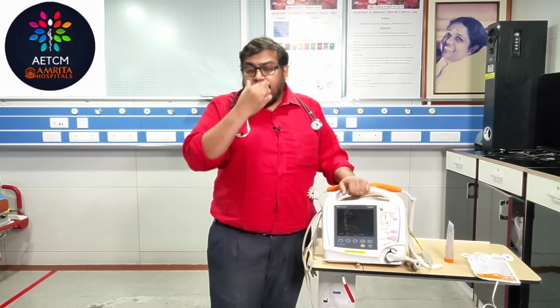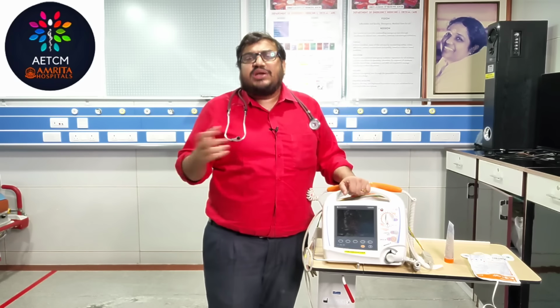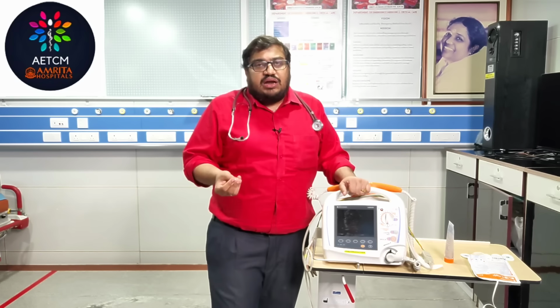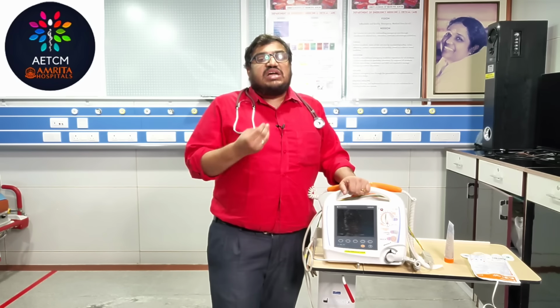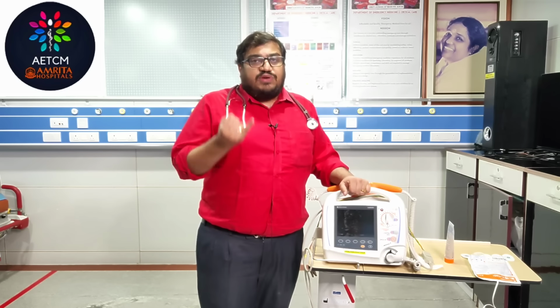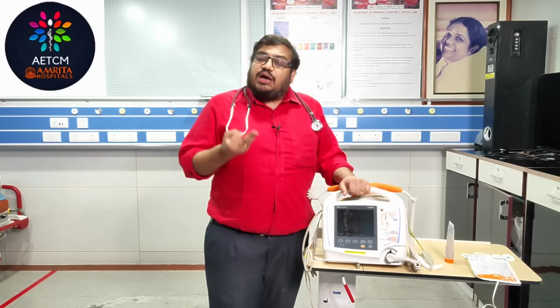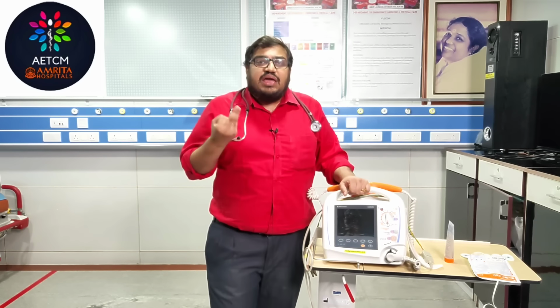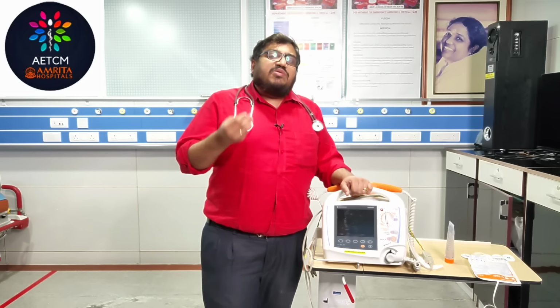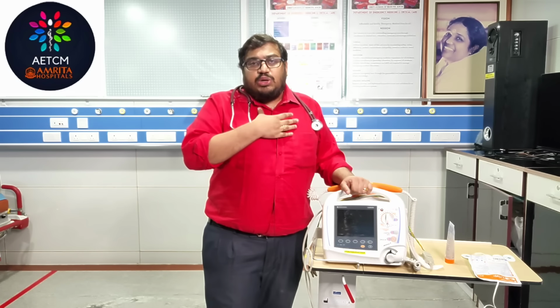We are thinking in terms of an SVT. A narrow complex irregular tachycardia, start with 120 joules, maximum of 200 joules. That is your atrial fibrillation or multifocal atrial tachycardia. A wide complex stable tachycardia, that is again your ventricular tachycardia with pulse, start with 100 joules. So I will repeat it again: narrow complex regular tachycardia 50 joules, narrow complex irregular tachycardia 120 to 200 joules, wide complex regular tachycardia 100 joules. So you are selecting a smaller dose of energy, and preferably we will use a biphasic defibrillator only. And after procedural sedation and after explaining to the patient, maybe you need to clean the chest also.